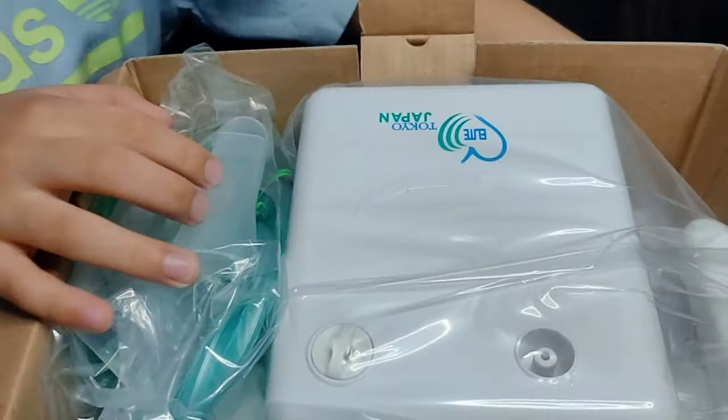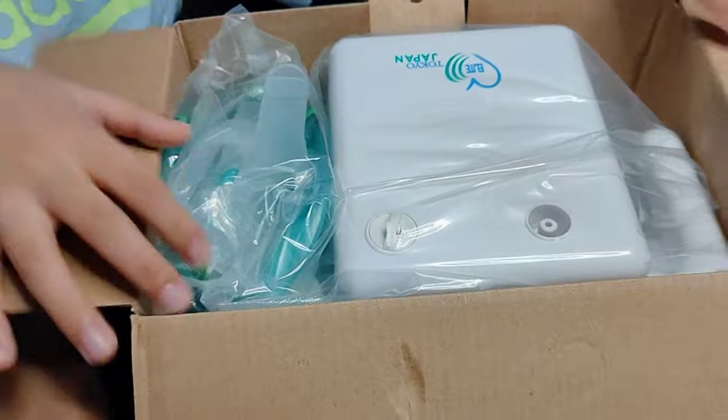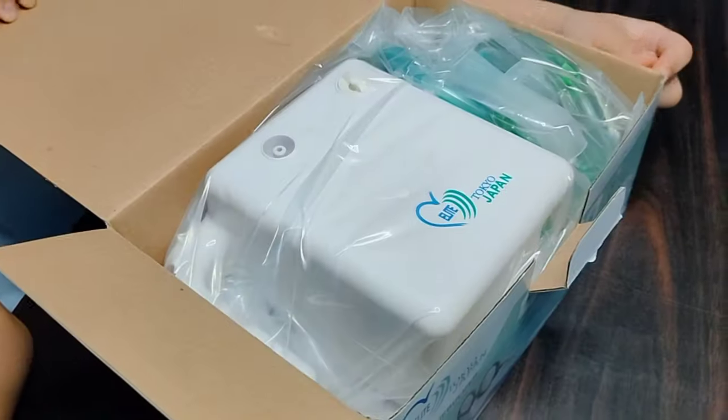Do you like this? Turn it around. One more.